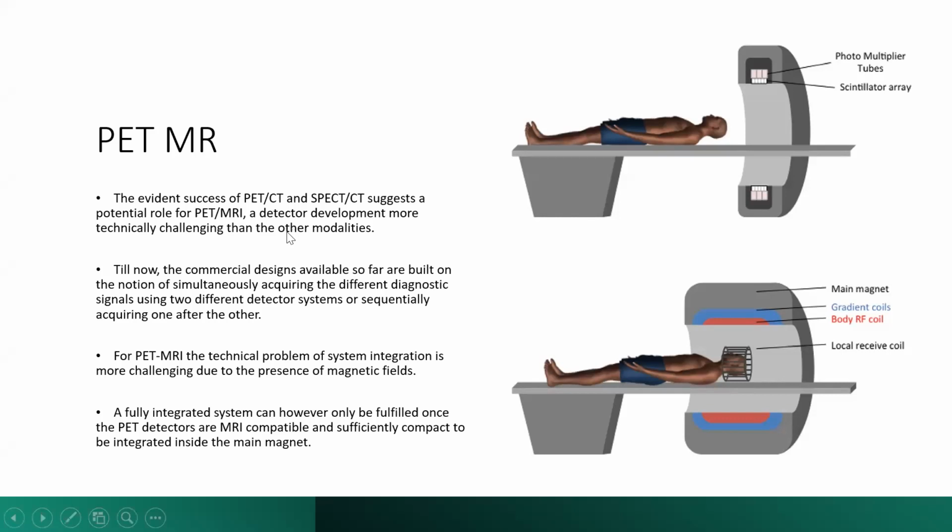So this is where the idea of PET-MR came from. They have the magnet and the detector at the same time. All the commercial designs available so far are built on the idea of having the two at the same time.